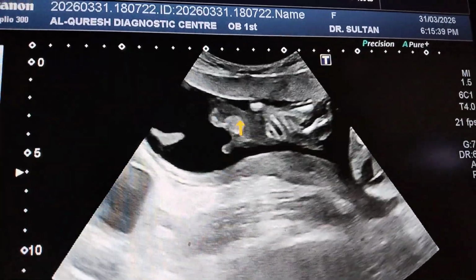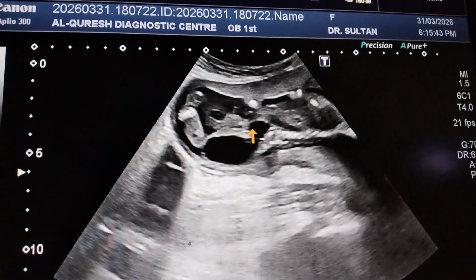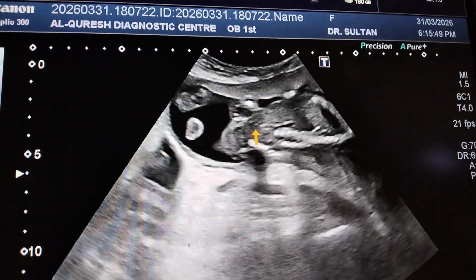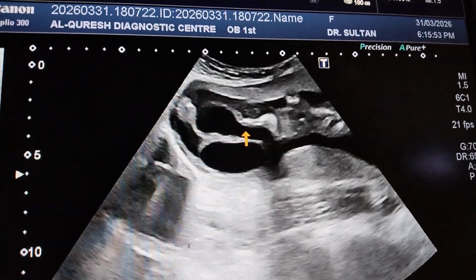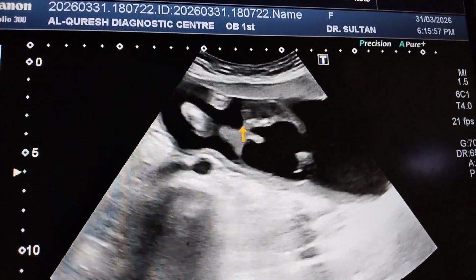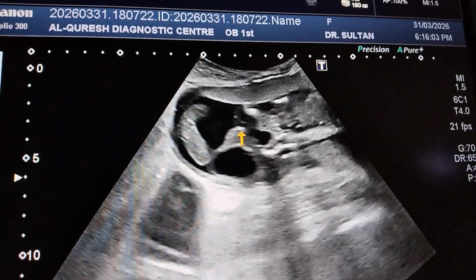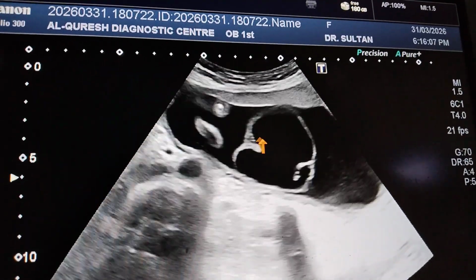So I have seen this. Look here. This is the pelvic region because this is the urinary bladder and this is the pelvic. So it is limited to the pelvic region. So we can say that it is sacrococcygeal teratoma type 2. And the complication it may cause, what we have seen, is that there is no solid component.